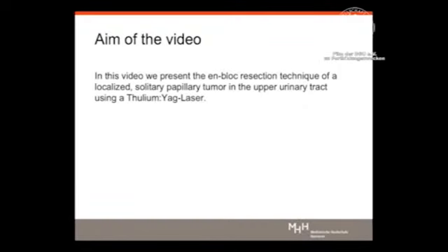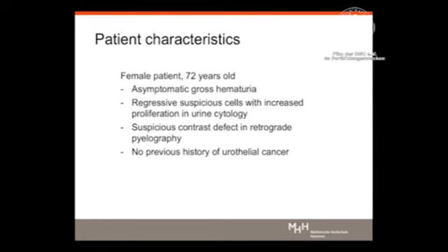In this video we present the en-bloc resection technique of a localized solitary papillary tumor in the upper urinary tract using a Thulium YAG-Laser. The 72-year-old female patient described an asymptomatic gross hematuria.